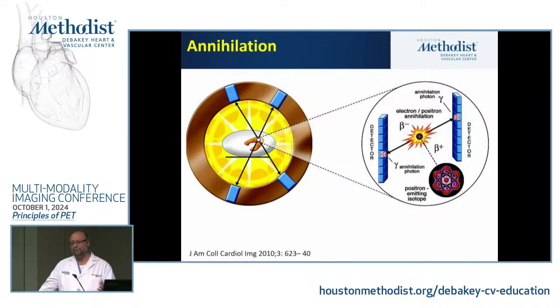So that's one of the tested areas where they will ask you what's one of the differences between SPECT and PET. It's the energy of the photon. So you're not only emitting two photons, but you're emitting them at 180 degrees, and they are much higher in energy. So we can detect two photons in multiple ways at 180 degrees. One of them is what you see here, a true event. When two photons hit the two rings at 180 degrees, the computer will say, this is a true event, and I'm going to record the point.